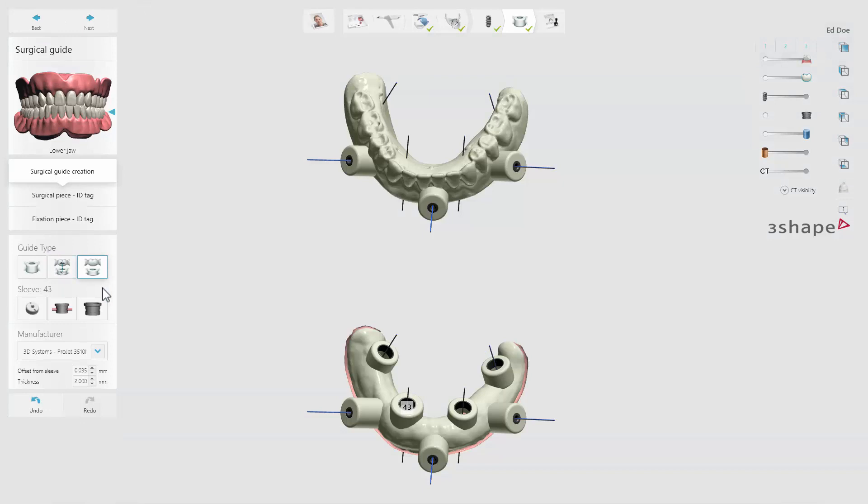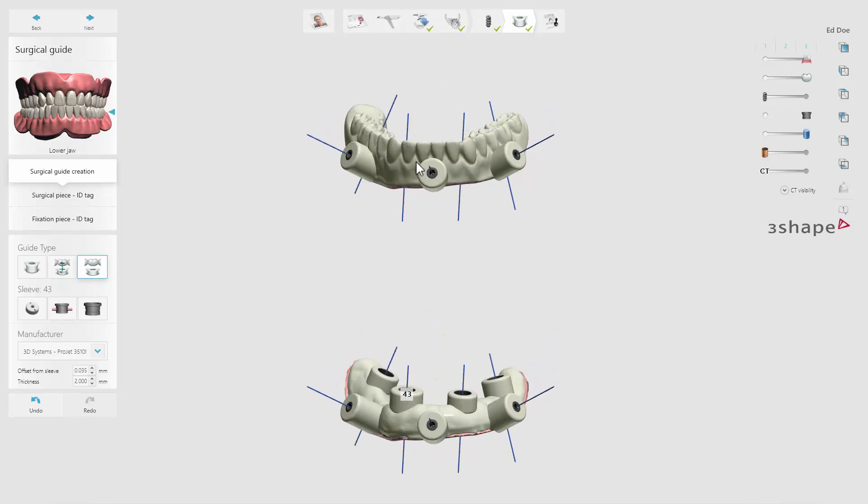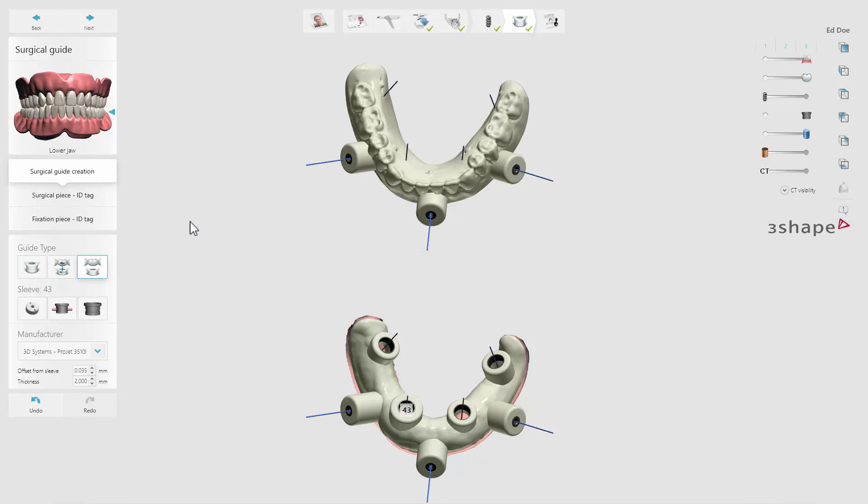The dual guide is actually two guides. They do not fit together like the two-piece guide, but are two separate guides with the exact same placement of the anchor pins, as they are designed simultaneously in Implant Studio. The dual guide is the perfect option for edentulous cases where you have accessibility concerns and where guide alignment to the opposing jaw is critical.